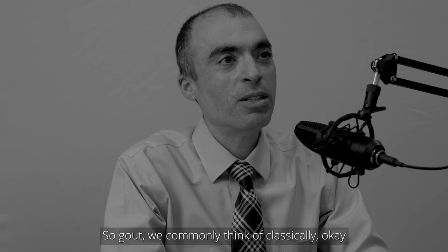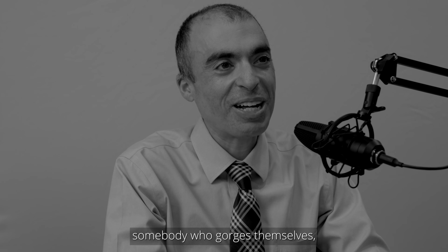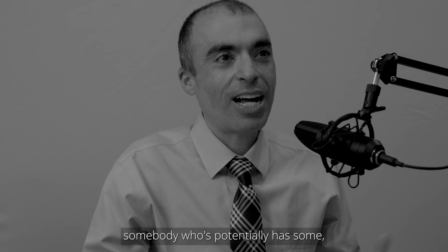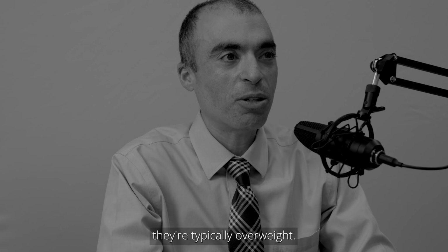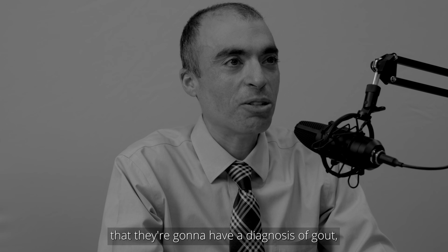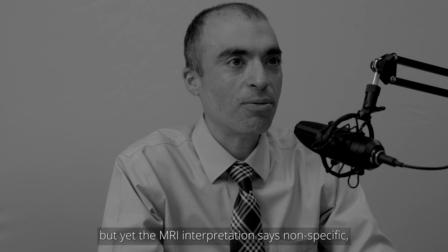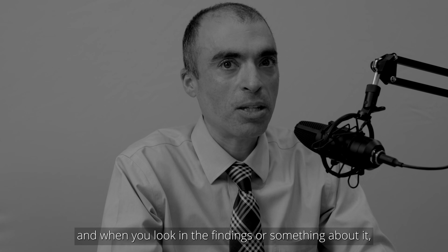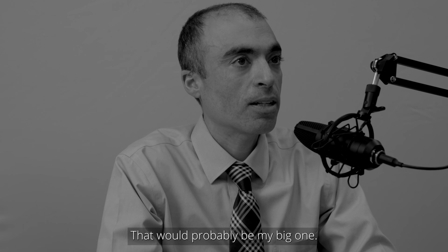Gout we commonly think of classically as somebody who gorges themselves, who potentially has some metabolic disorder, typically overweight. But what if it's a 25-year-old athlete? It seems unlikely that they're going to have a diagnosis of gout, yet the MRI interpretation says non-specific, and in the findings it's an intermediate to low signal mass. That would probably be my big one.